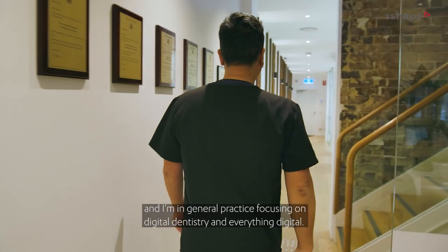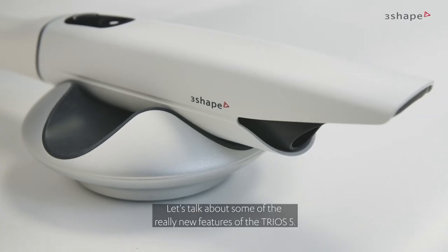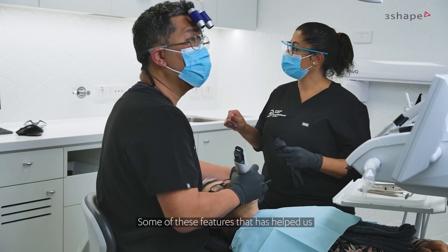My name is Anthony Mack and I'm from Sydney, Australia. I'm in general practice focusing on digital dentistry and everything digital. Let's talk about some of the really new features of the Trios 5.